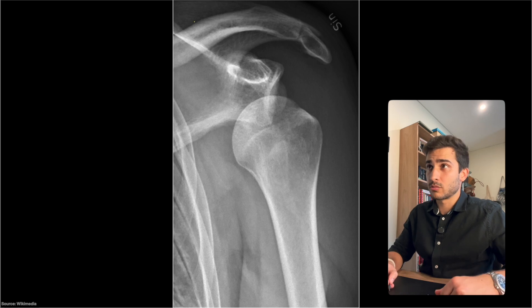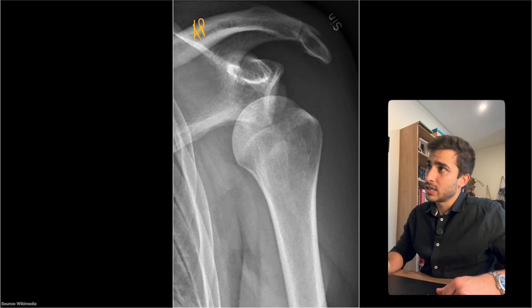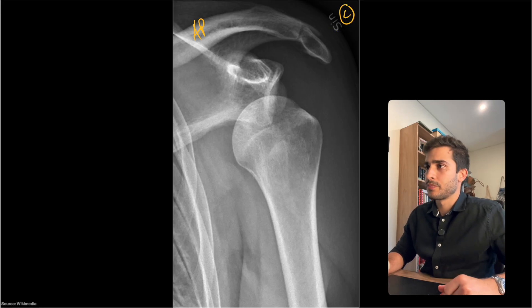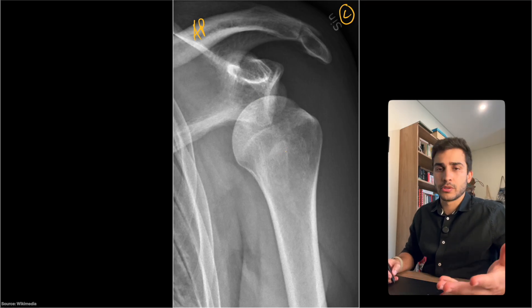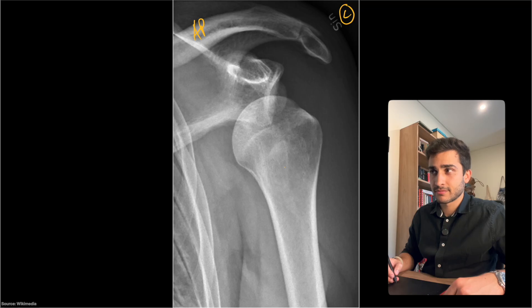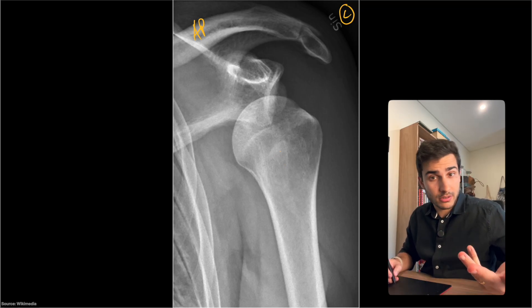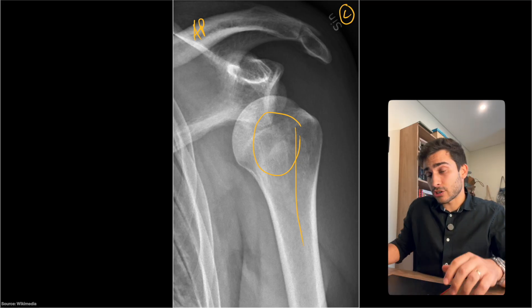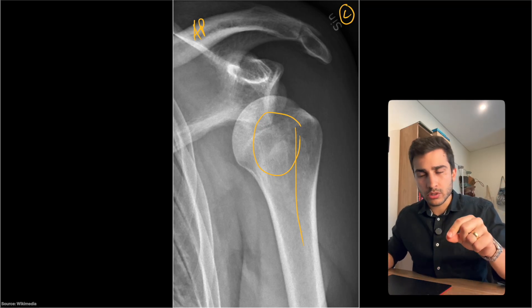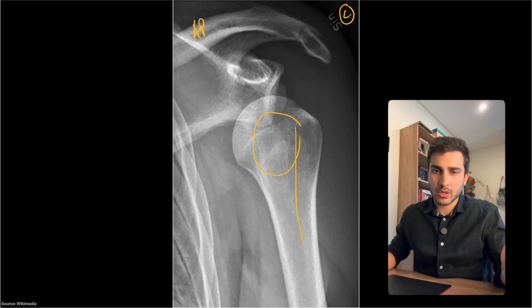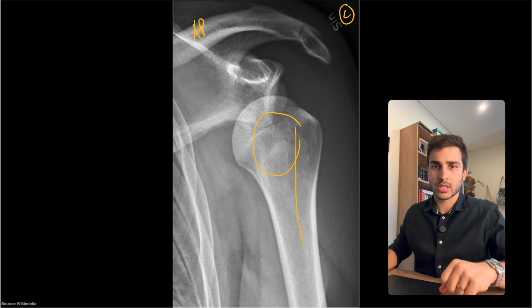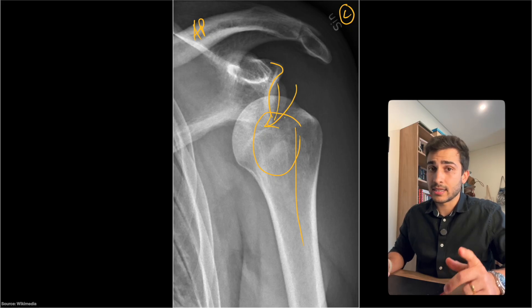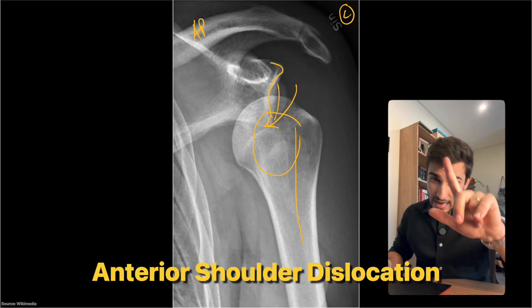Last case — again we're looking at the AP of the left shoulder. The 'L' marker represents left. Does it look like the light bulb sign or P or Q? Hopefully you said it looks like a Q. So if it's the left shoulder and externally rotated, it looks like a Q; if it's the right shoulder and externally rotated, it looks like a P — that's why it looks either like a P or Q depending on which side it is. Combined with dislodgement from the glenoid fossa, it is an anterior dislocation.